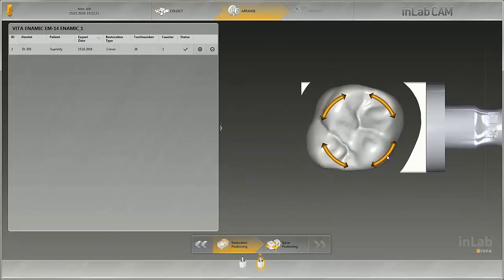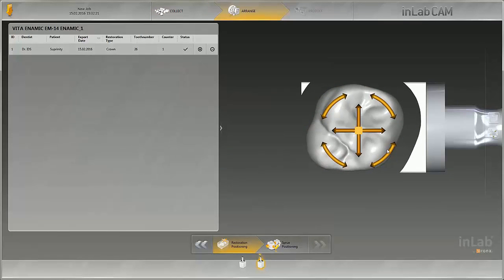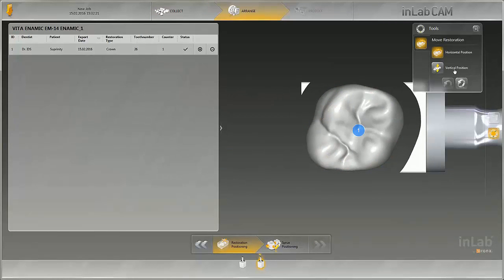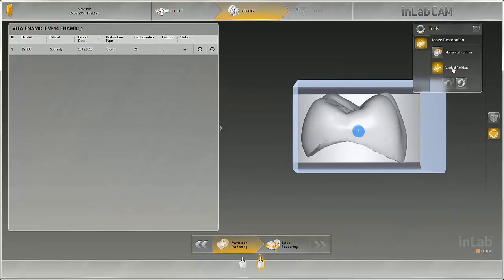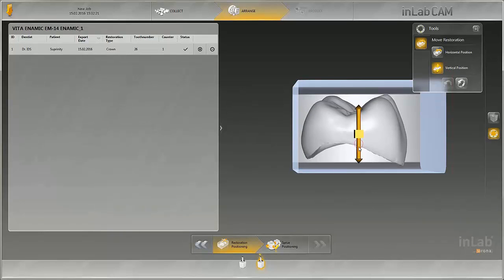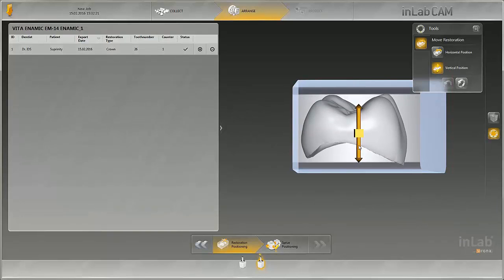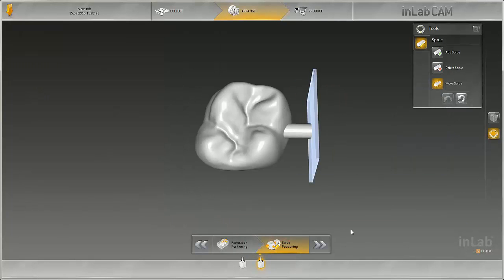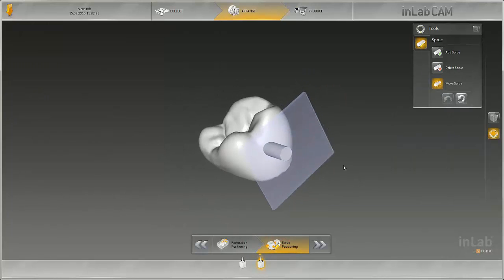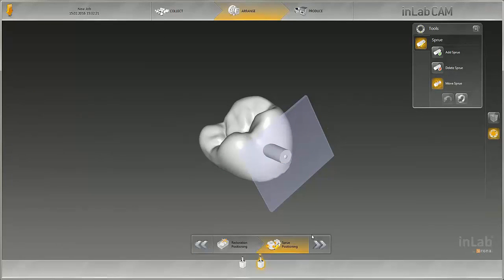Restorations can be positioned both horizontally and vertically. After positioning the connector, the crown is added to the multi-block holder by clicking on the next arrow.